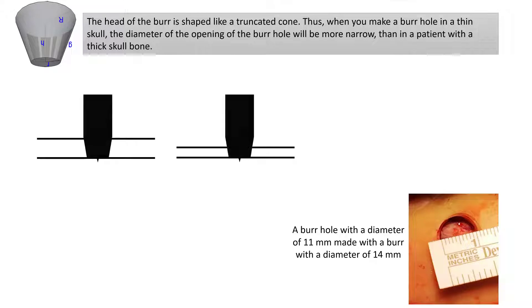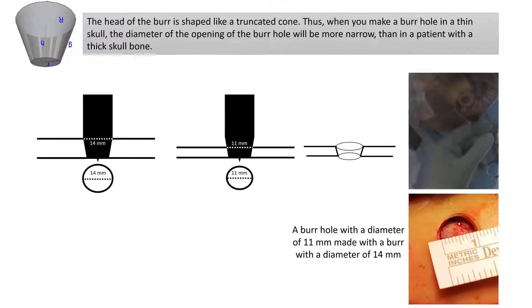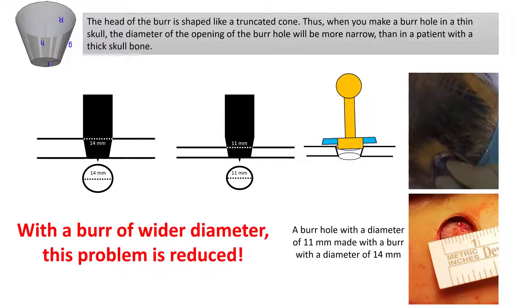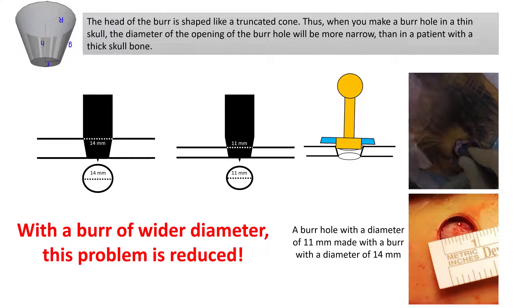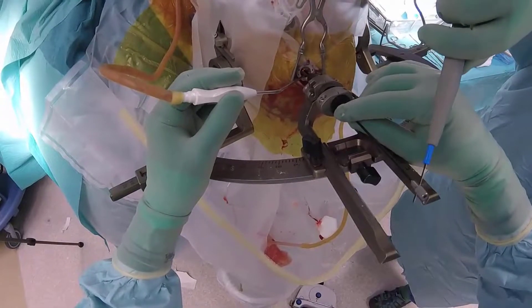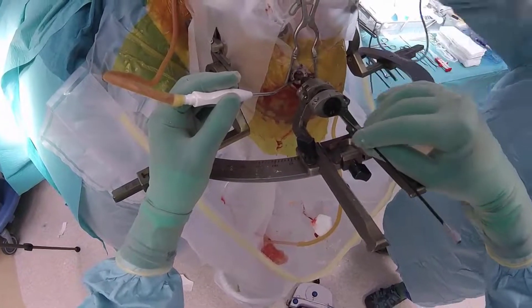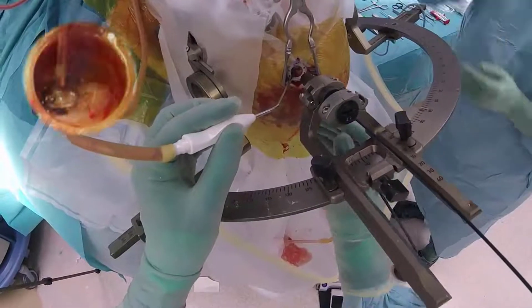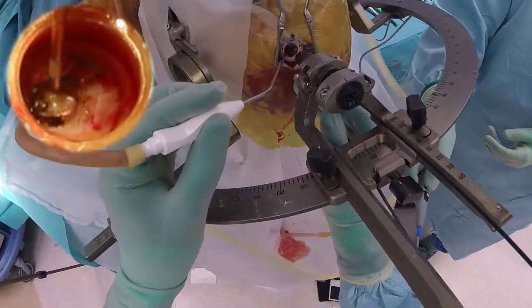Sometimes we will need to enlarge the burr hole to fit the anchoring device. This can often be avoided by using a burr of a wider diameter. To perform the durotomy and corticotomy with monopolar diathermy in the manner seen here is fast and will provide you with a well centered opening.